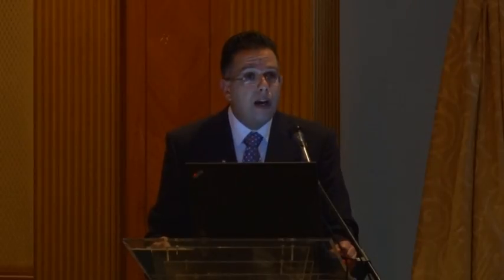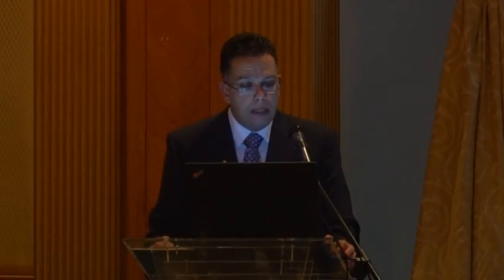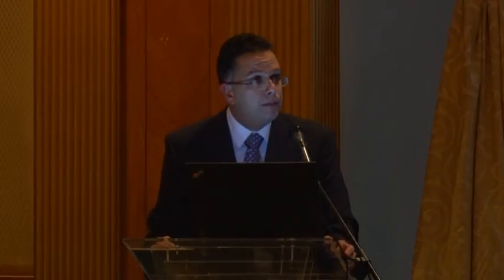Wow, we can get it with CT. Yes, we can. Another one, we can see this section. As we said, we have a very high spatial resolution with CT, and we are going up to 0.5 millimeter, and you can see that we can even see the dissection line within the coronary artery.